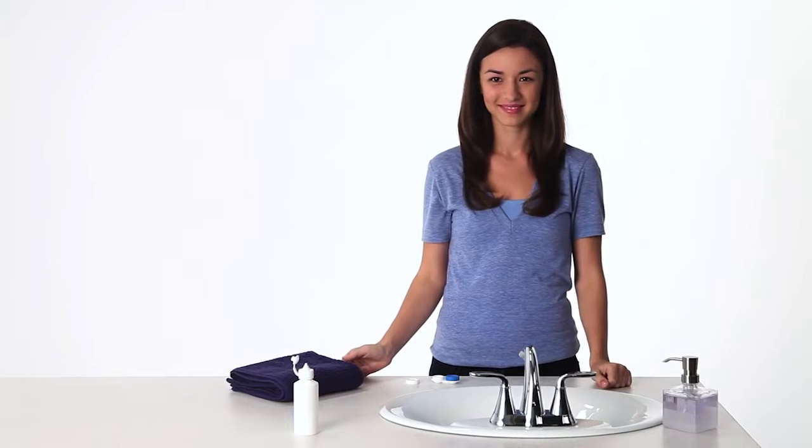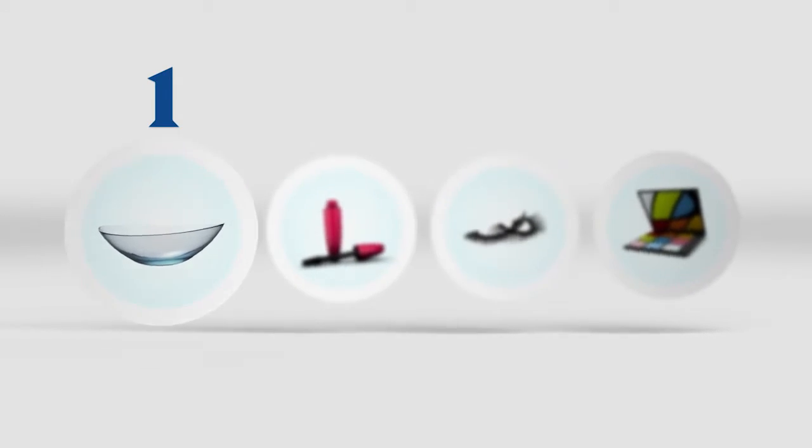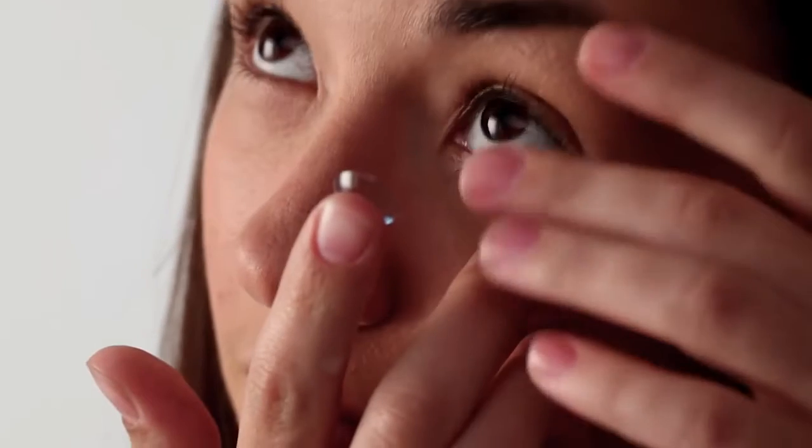And that's it! One more tip: if you wear makeup, put your contacts on first, so any makeup on your hands doesn't wind up on the lenses. Now do it again with your left eye. Bye!